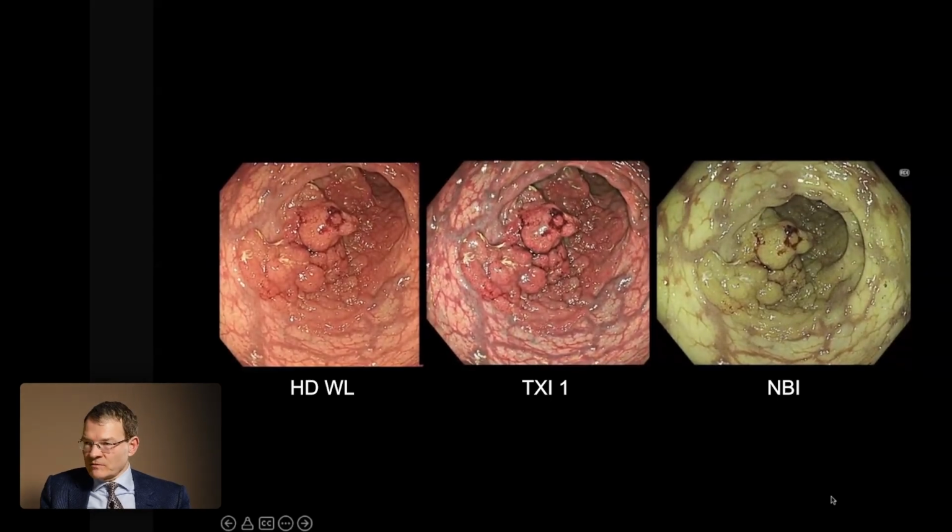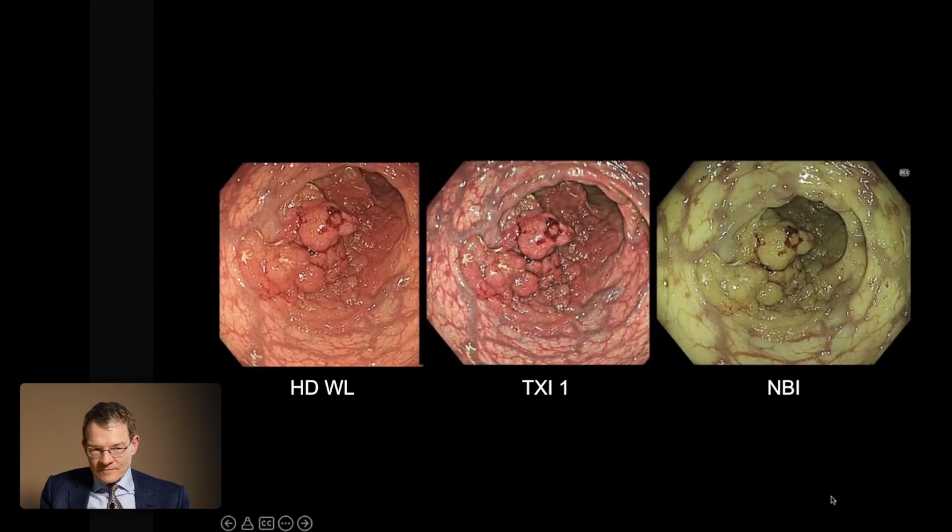And I think sometimes when we start with an ESD, we have the problem that we start with the injection and already we have created a hematoma and we lose a lot of time. And it's bleeding from the injection site. Yeah. Exactly. So I think now I'm starting the submucosal injection always by using RDI. So it also has a somehow diagnostic aspect. Okay, so you think, or you feel it's easier to avoid the vessels? Definitely, yes.